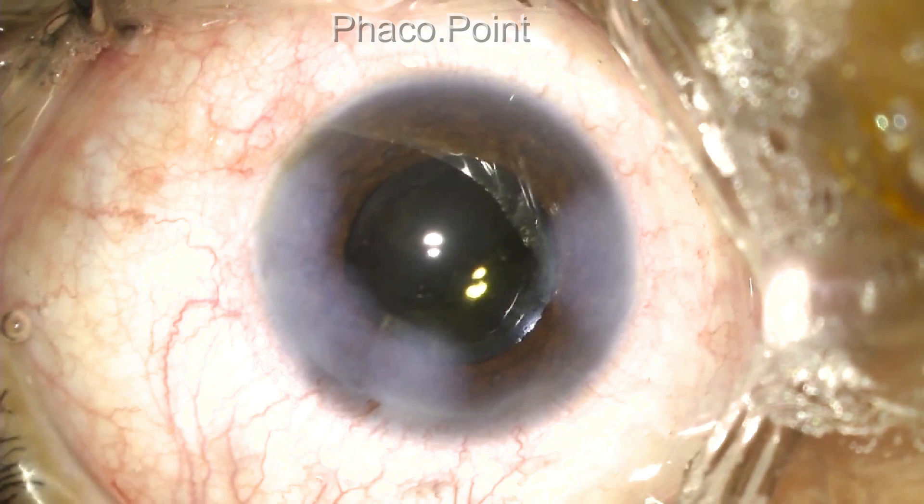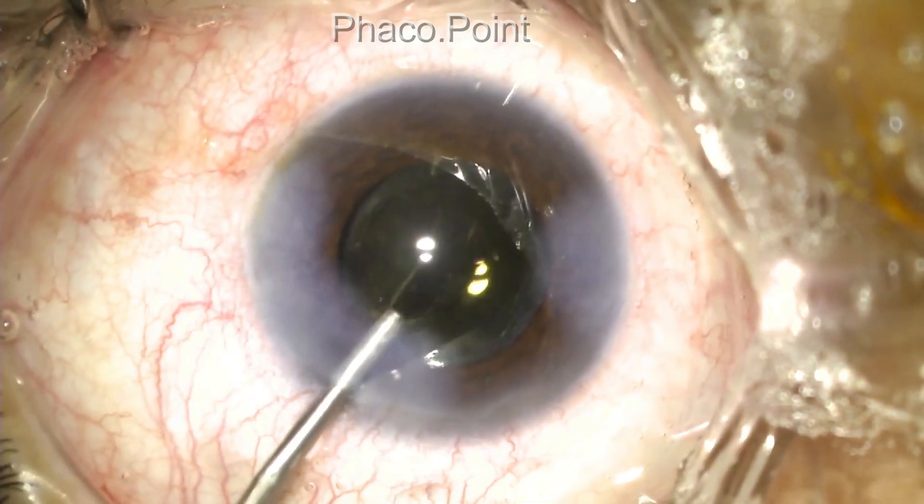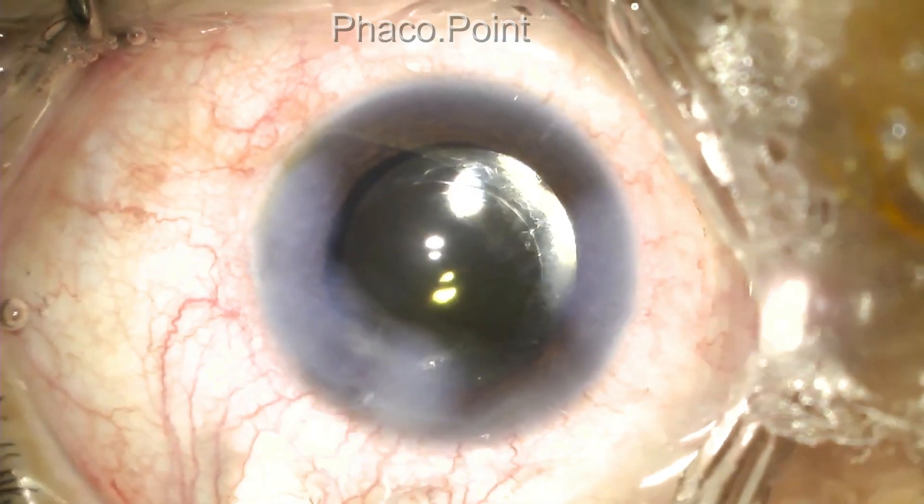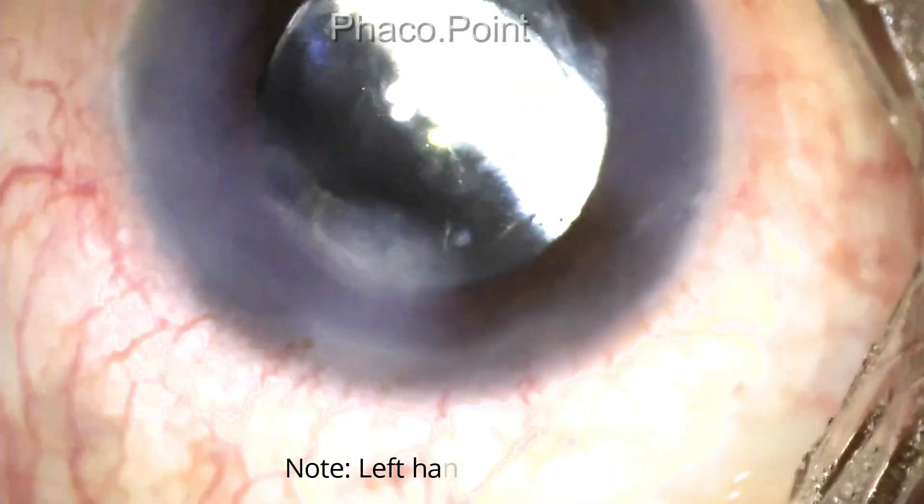Now here's how it's done. At the outset, I introduce some viscoelastic into the anterior chamber to protect the corneal endothelium from damage. I then proceed to performing the surgical iridectomy.